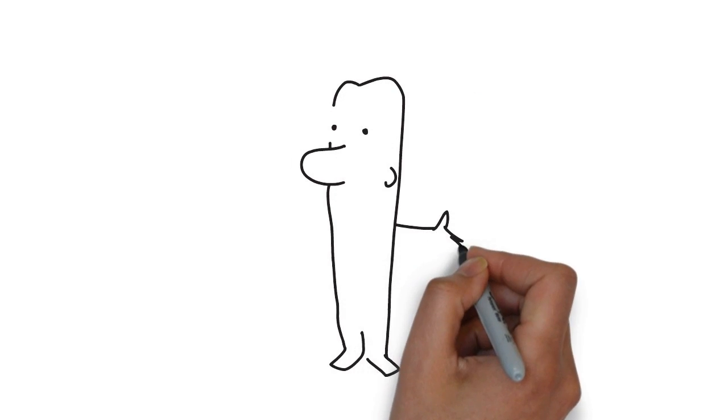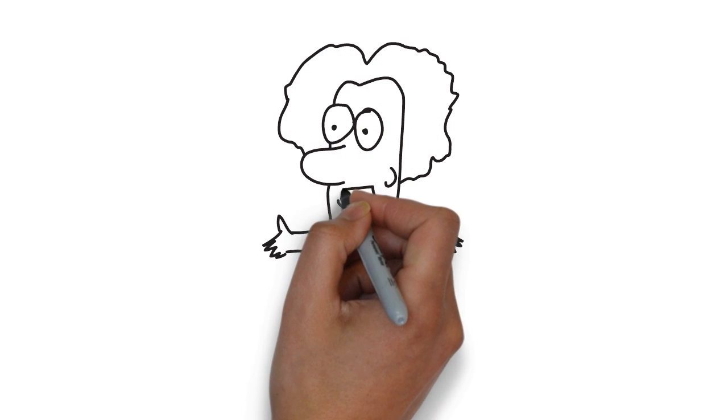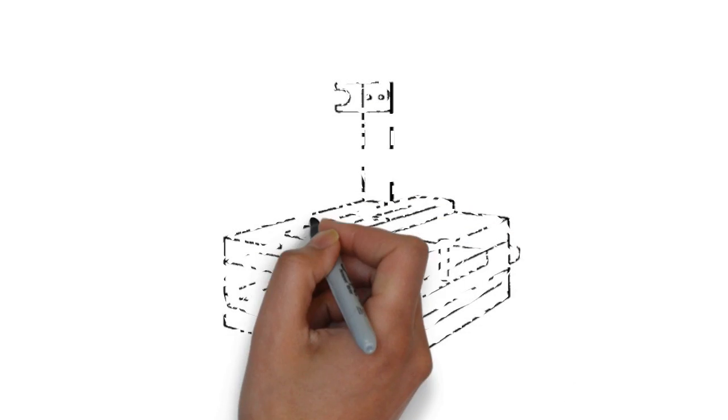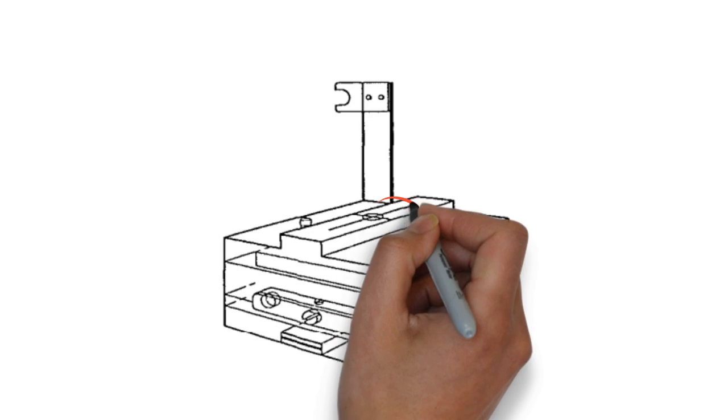So who determines what the DRLs are here at Cascadia Health? Is it the technologist? Is it the supervisor? It's the medical physicist! Way above our pay grade. So before this new X-ray tube is installed, the medical physicist will perform QC tests to determine appropriate DRLs.